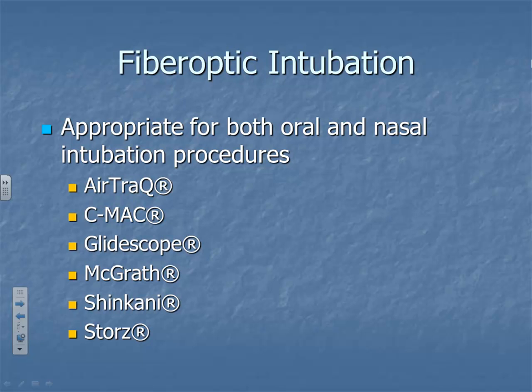There's something called fiber optic intubation now, where it actually comes with a little screen. And as you insert your device, whatever you're using, you have a little screen, and it shows you in big color what's going on inside. So you're intubating here and you're looking at your screen there. Personally, I'm going to feel better seeing those cords myself, but these are available. Is anybody around here using them? Somebody's moving to it, yeah.